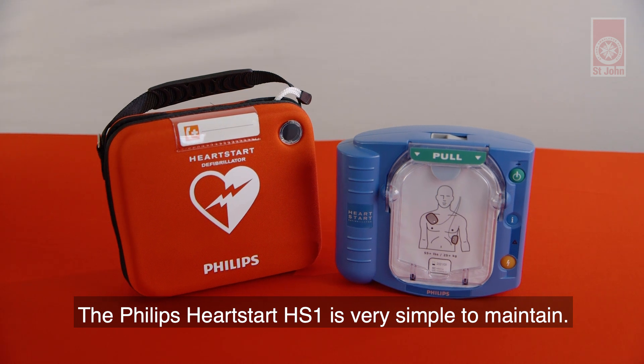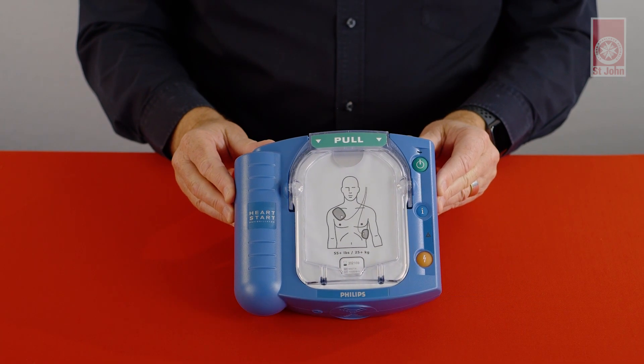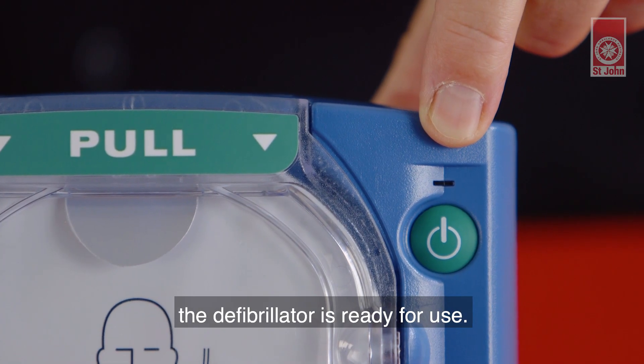The Philips HeartStart HS1 is very simple to maintain. Firstly, check the green ready light. If the ready light is blinking, the defibrillator is ready for use.